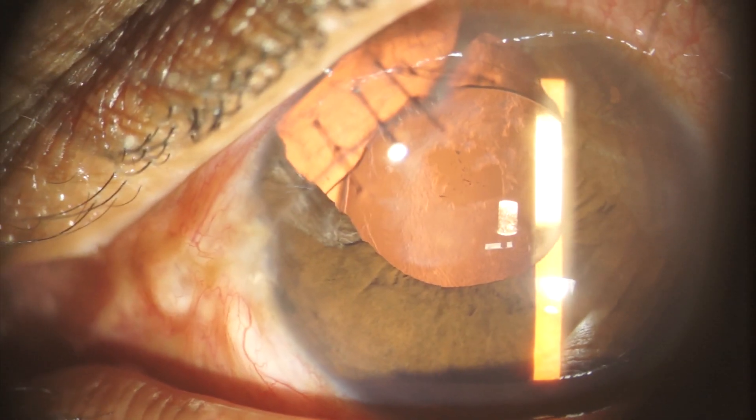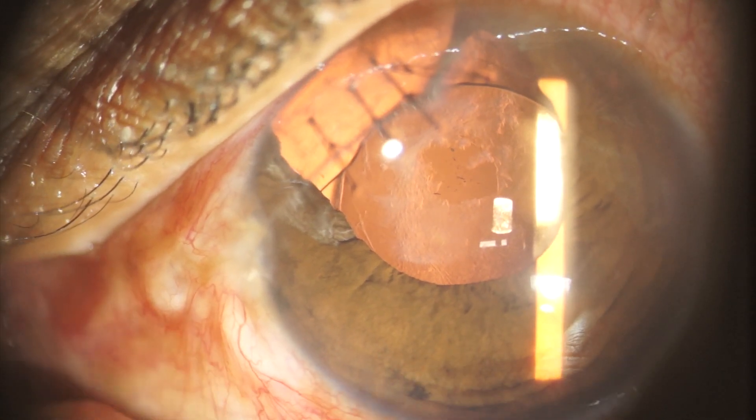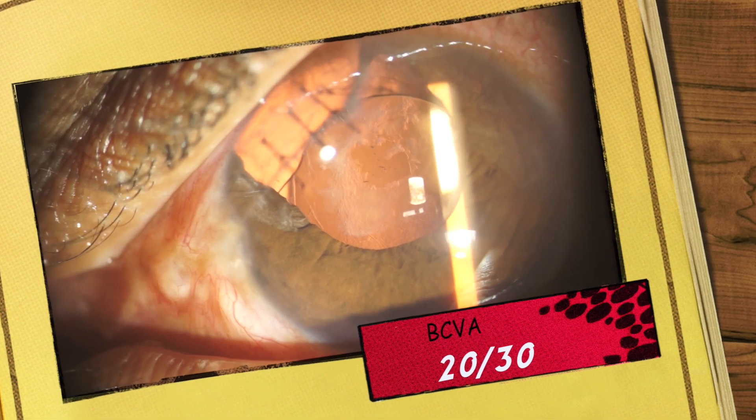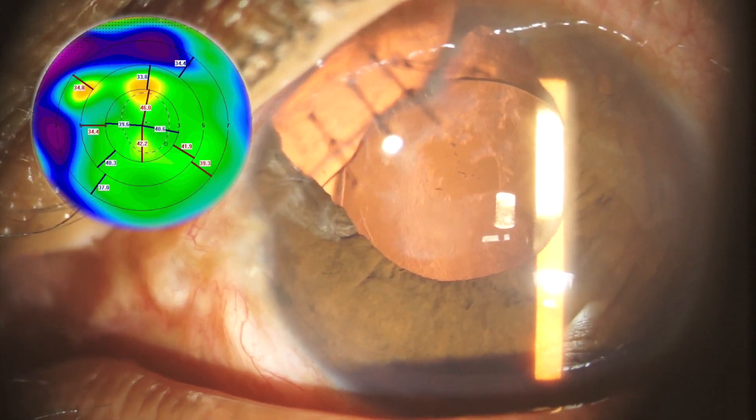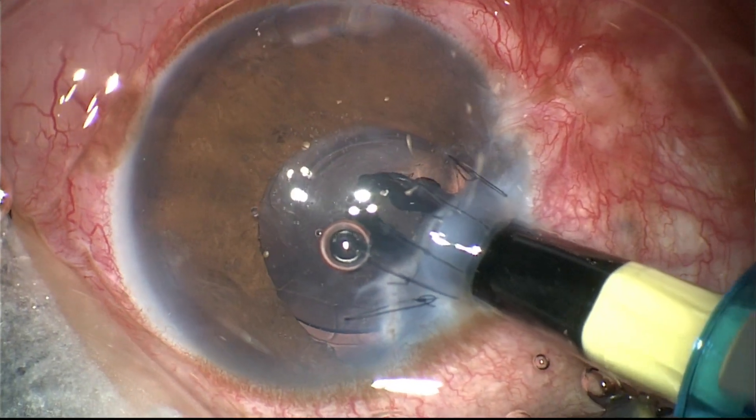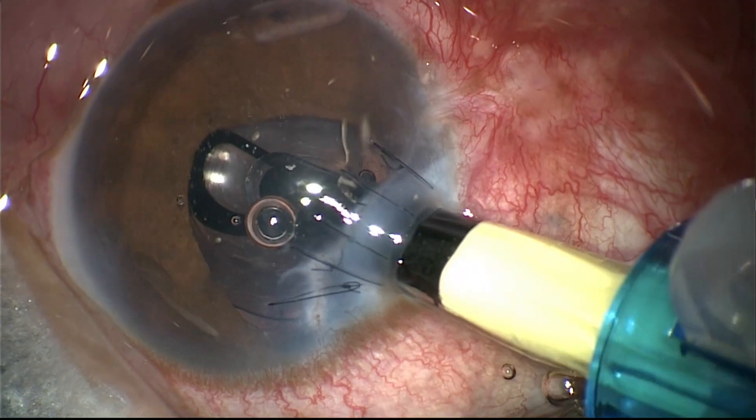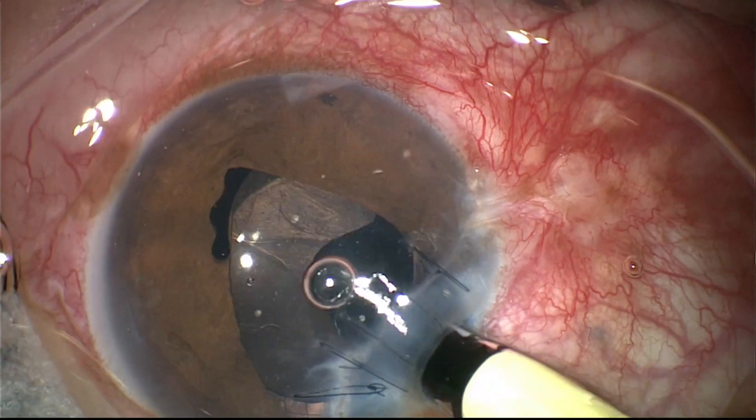However, after this initial treatment, he complained of disturbing glare and poor visual acuity, due to the combination of a highly aberrated cornea and a large pupil. The incision was made posterior to the corneal laceration, and the implant is carefully directed to the ciliary sulcus.